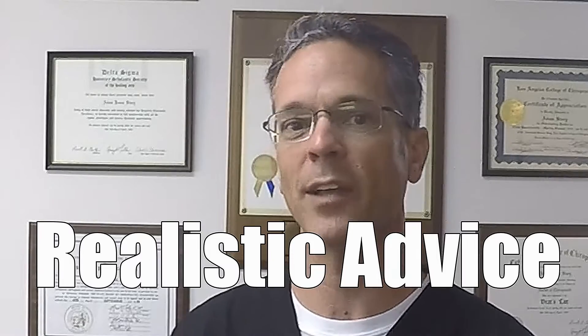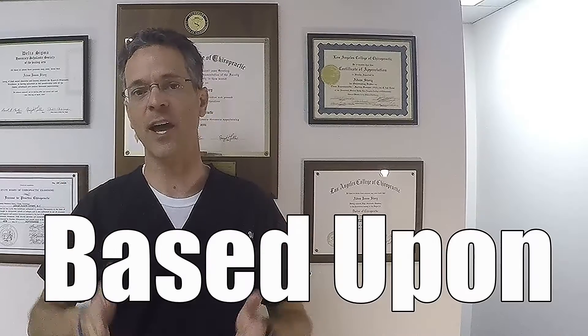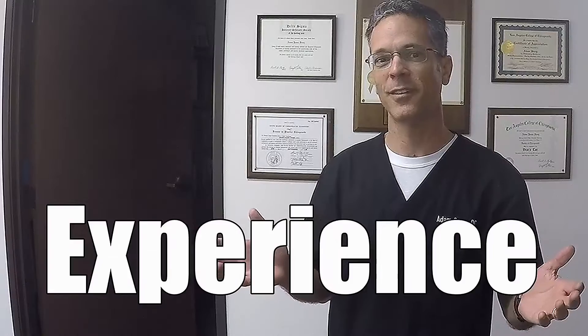How do you take your own blood pressure? In this video, I'm going to tell you exactly how to do it. Taking your own blood pressure is actually very simple.